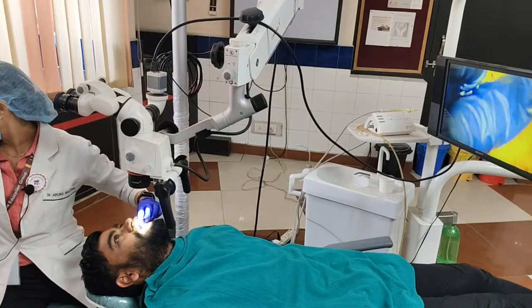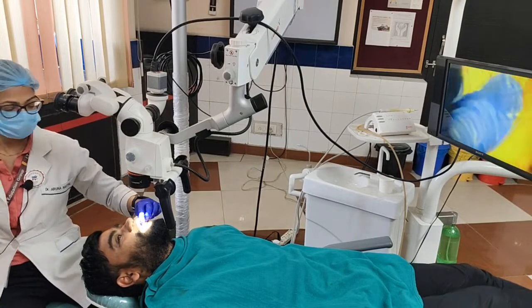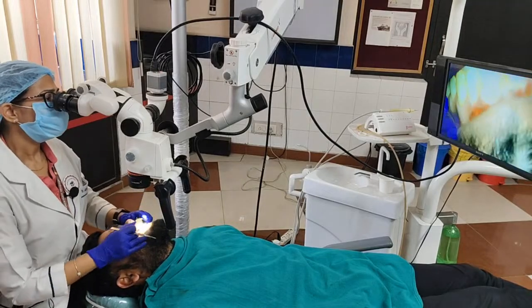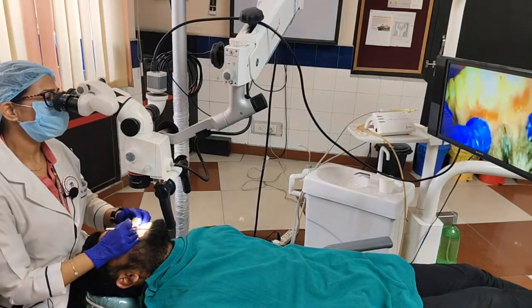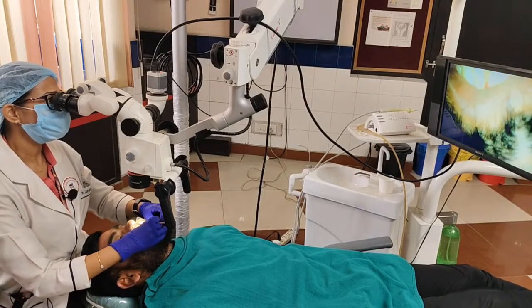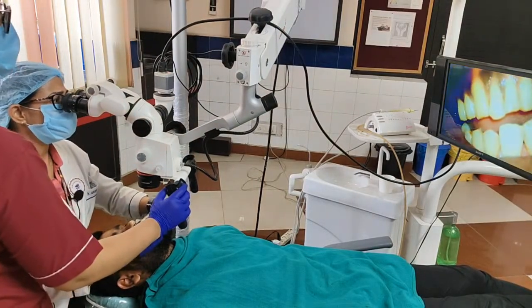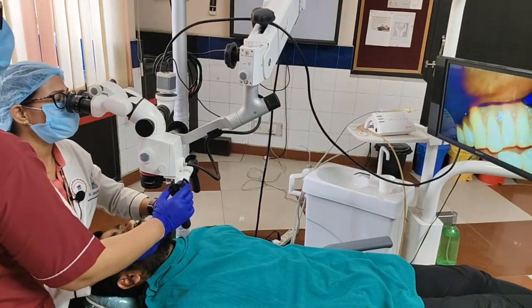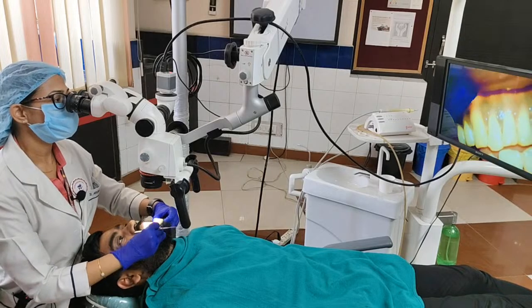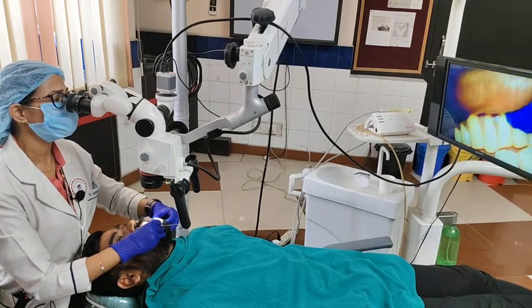Is the video on now? Yes, ma'am. Okay. So we'll just see if this patient is able to stay back. He agrees. He has pigmentation here also. Probably you can do laser on this. So I leave this for laser so that you can have a demo of laser on this part.